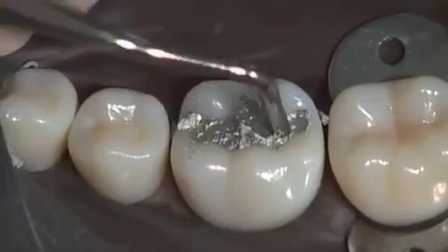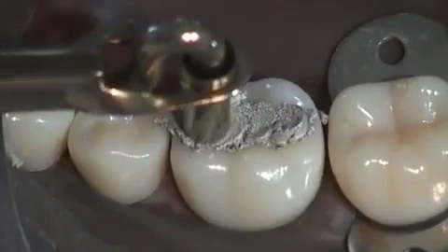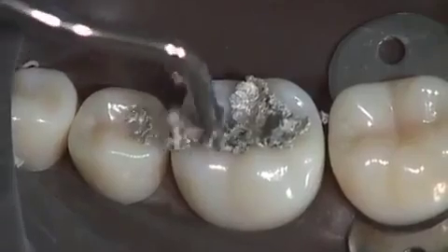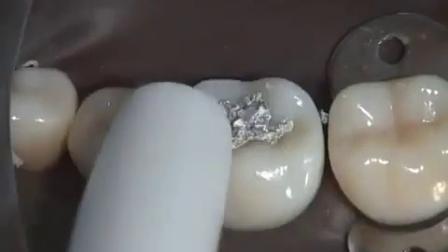You can overfill the preparation with another batch of amalgam to ensure that there will be no shortage of amalgam and consequent ledge between amalgam and natural tooth after condensation is completed. Use a high volume suction device to remove any excess.